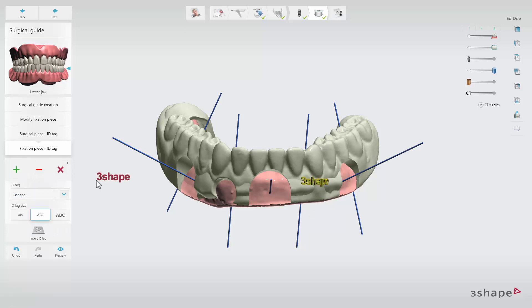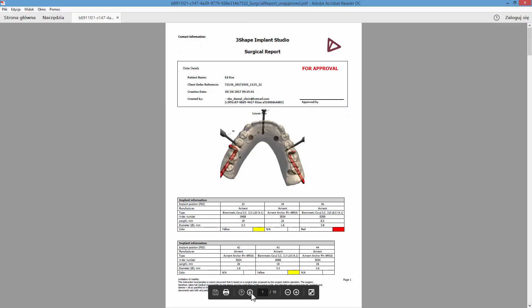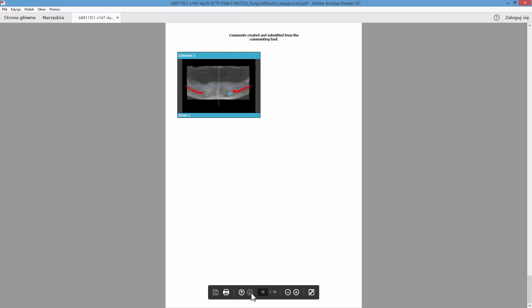When the guide design is finalised, click Next to proceed to the Save step. Preview the surgical report before approval by clicking the Show Surgical Report button. If you are satisfied with it, you can proceed to the Approvals.